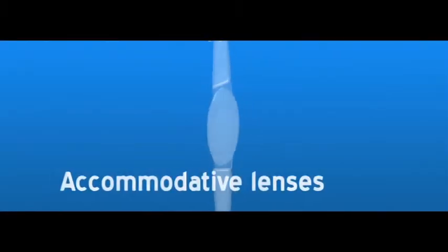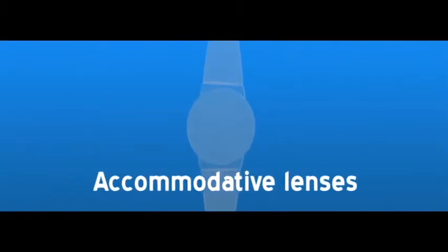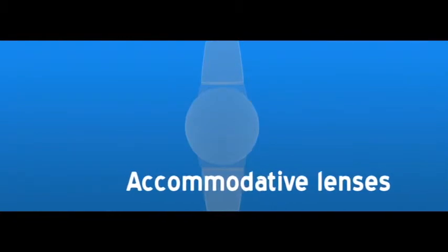The ability to read without glasses varies from person to person, but is generally best when a multifocal lens implant is placed in both eyes. Multifocal lenses give you the potential to see both near and far without glasses. It usually takes anywhere from 6 to 12 weeks after placement of the second lens for your brain to adapt and to achieve the best near vision. An accommodative lens uses a different technique to enable patients to see better without eyeglasses.